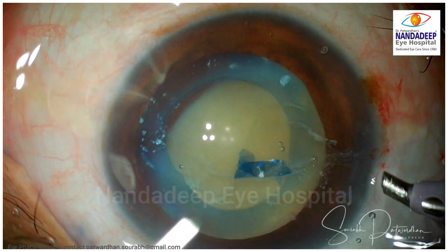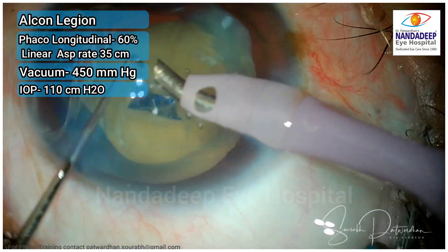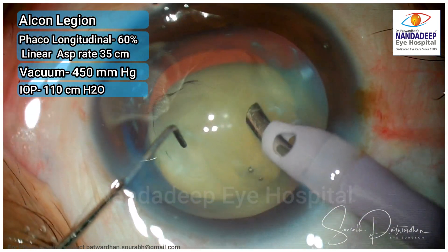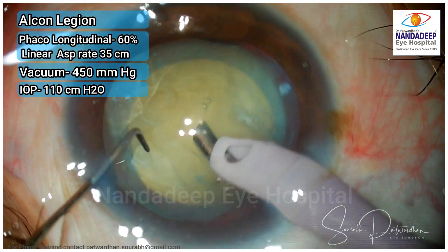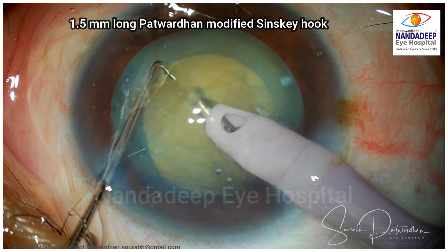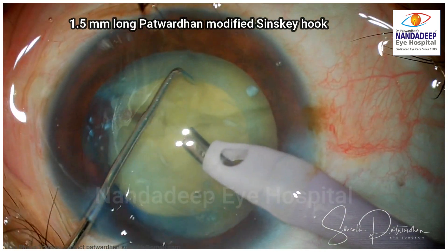The size of capsulorhexis here is around 4.5 mm but it is adequate because the nucleus is small. Now what I am going to do here is to do a horizontal chop. Those are the parameters I am going to use — the longitudinal linear power. Here I want to bury into this nucleus a little paracentrally, not near the center but near the mid periphery, so that I can go around the edge of the nucleus and then chop.